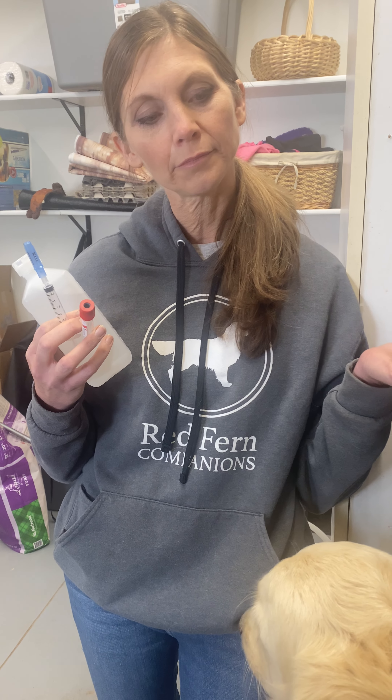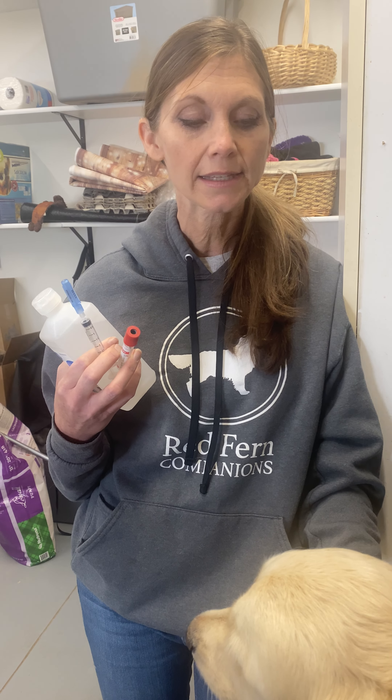We are going to demonstrate drawing blood on your females. The situation that you may need to draw blood for is progesterone testing. Maybe if you've got a sick female and you need to get blood tested, you can take in a sample of blood.